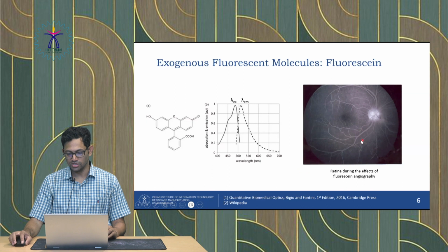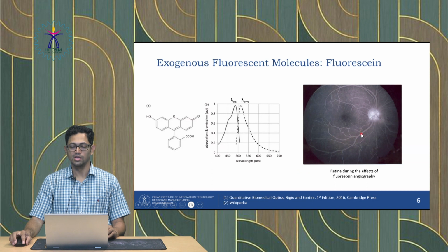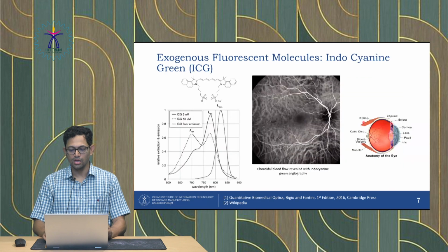And you can see these bright colors that are illuminating the blood vessels, right. That is only because of the dye that we have been using. So, there is a significant increase in the contrast to differentiate the blood vessels. So, you can do the angiography, which also means you can understand where the blockage is within the eye. Okay.